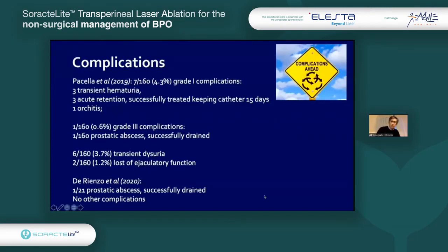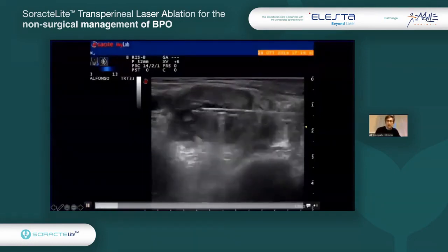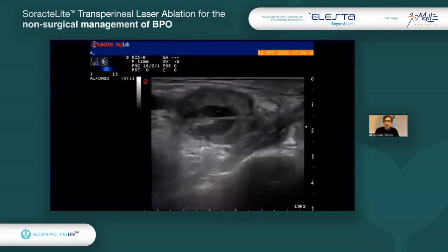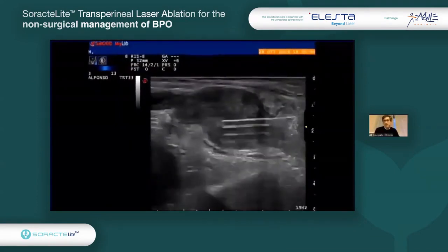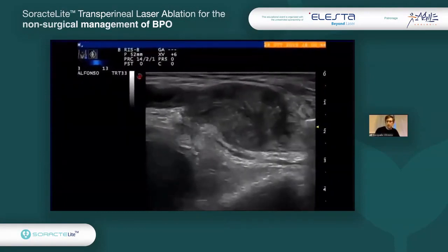In our case, we have 1 abscess, and that patient had very severe dysuria. We drained it transperineally, and this is the video. I'll show you the procedure we did at the end. And after that, the patient was in very good condition and resolved all the symptoms.